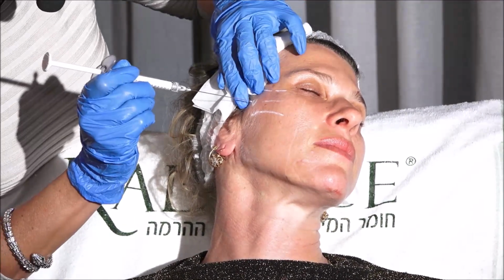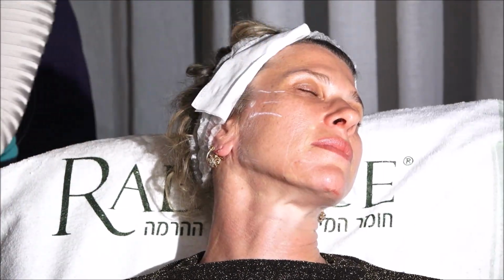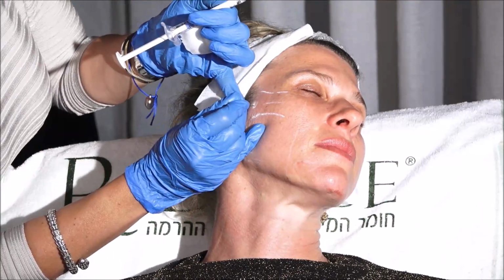I think I did the pinch here, but no. Yes. I thought I did.